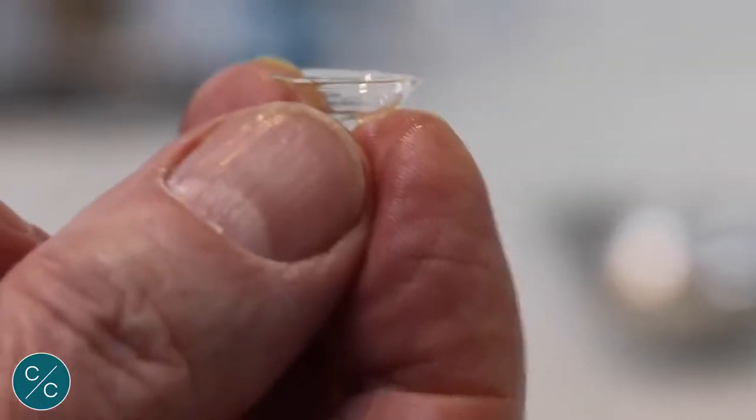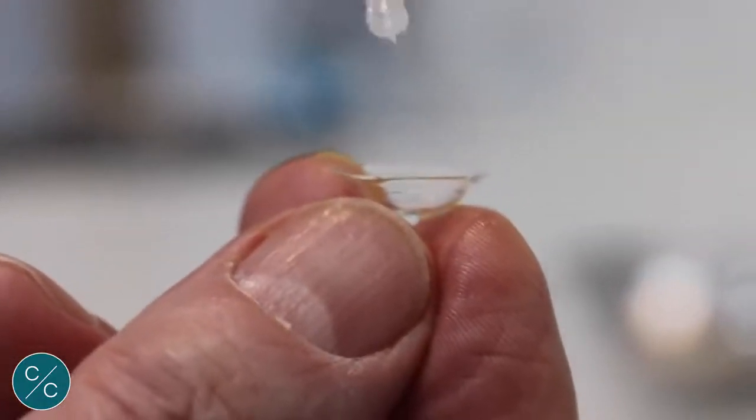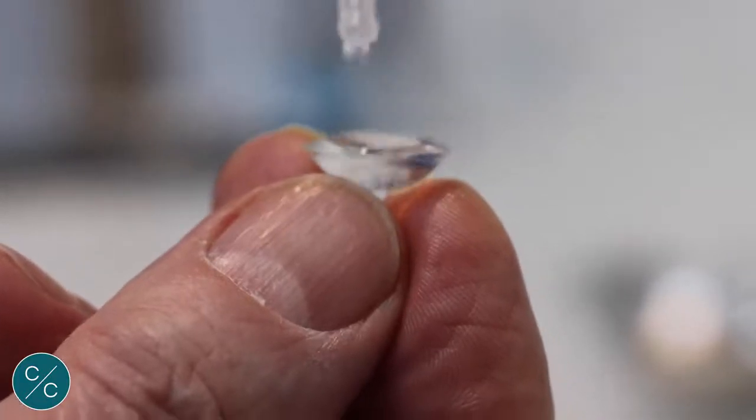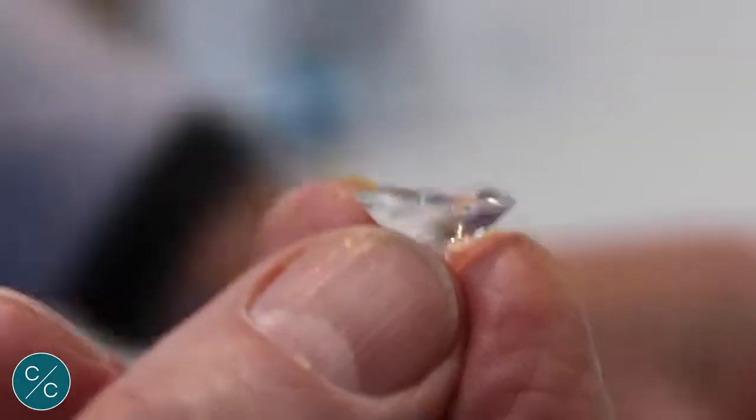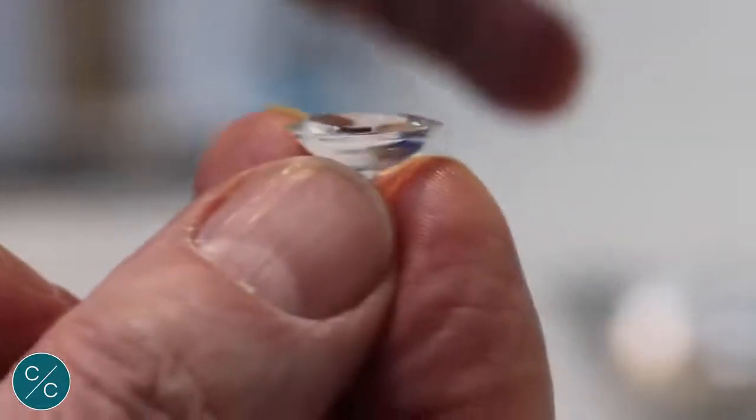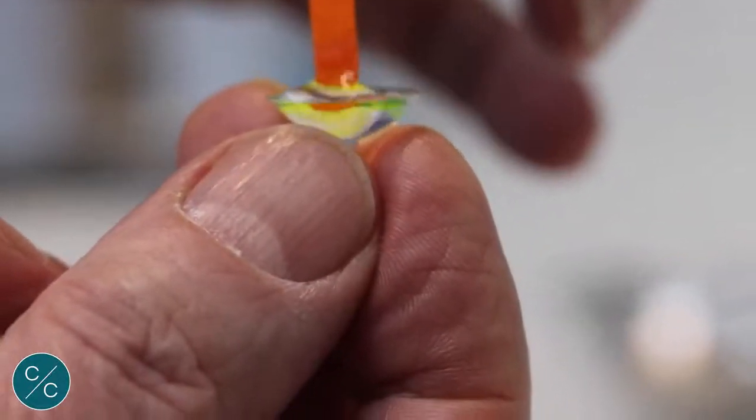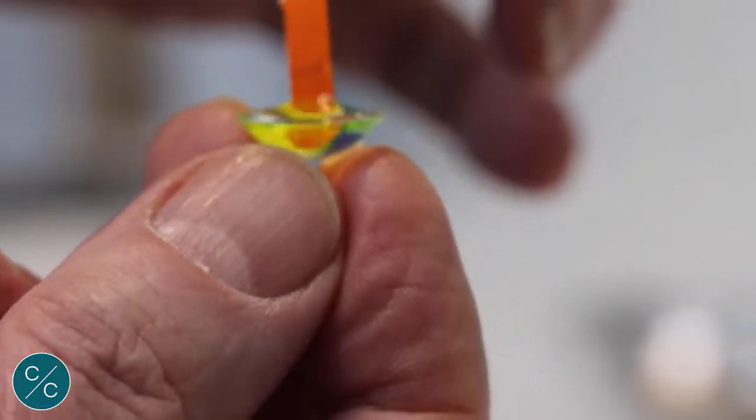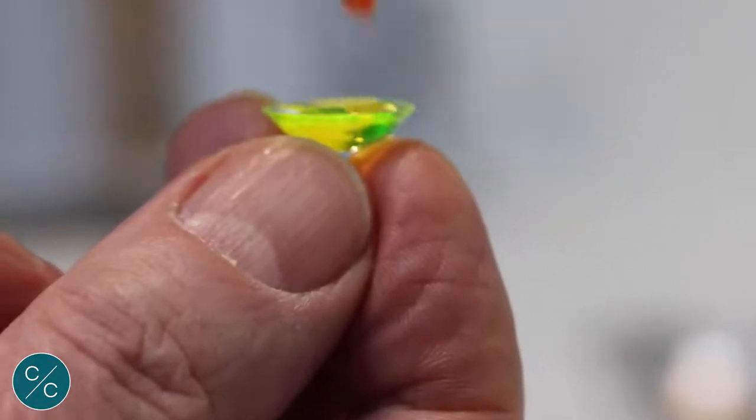So we take our lens, fill to overflowing with saline, take our Fluorescein strip and introduce Fluorescein into the bowl of the lens and we're ready to go.